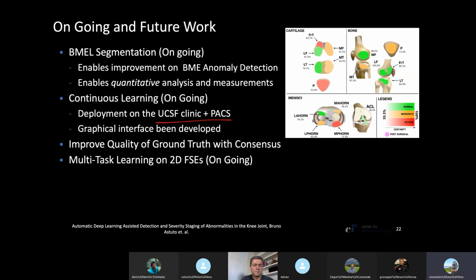One question. Have you tried semi-supervised learning? Because I think that there are not that many images in your work, right? Yeah. And you train with the image like a weakly supervised setup, right? So we give the image and say, okay, there's a lesion in this image, but the model doesn't know where or what it looks like. We just say, here's the image and there's a lesion here, and the model needs to learn. So it's a weakly supervised training.